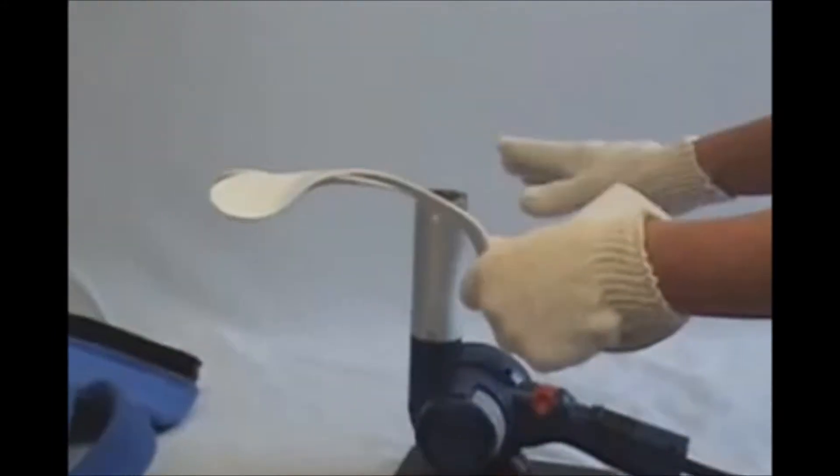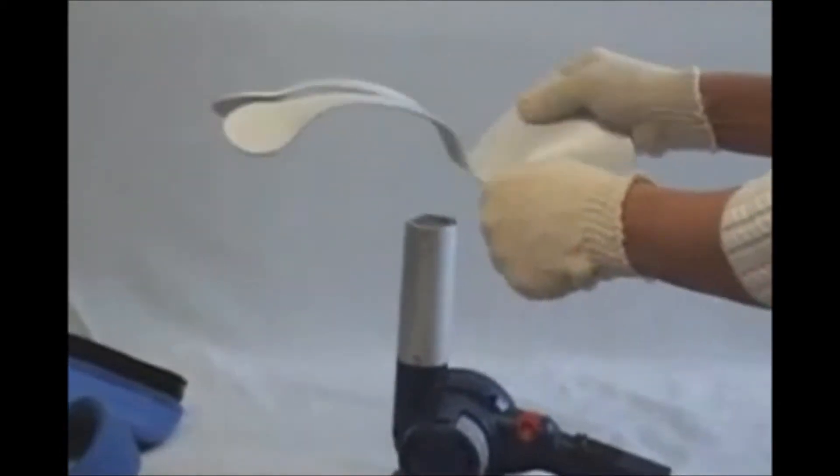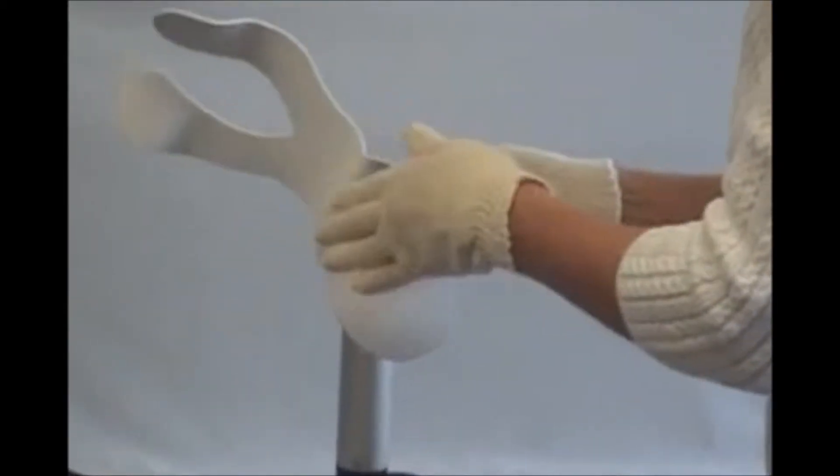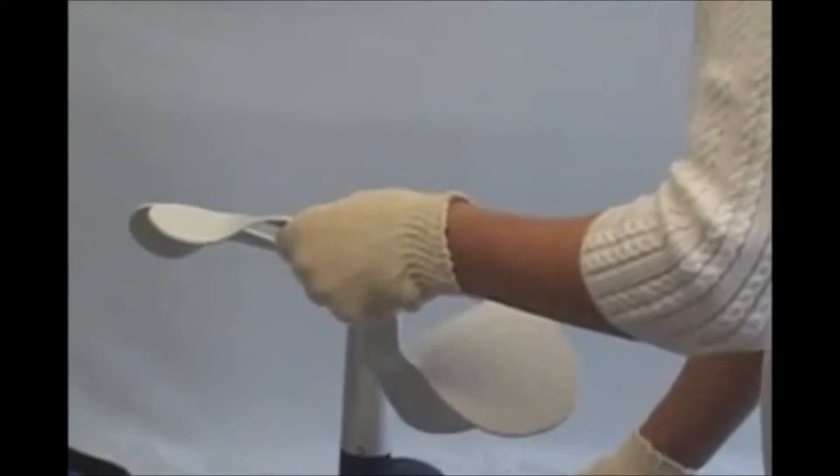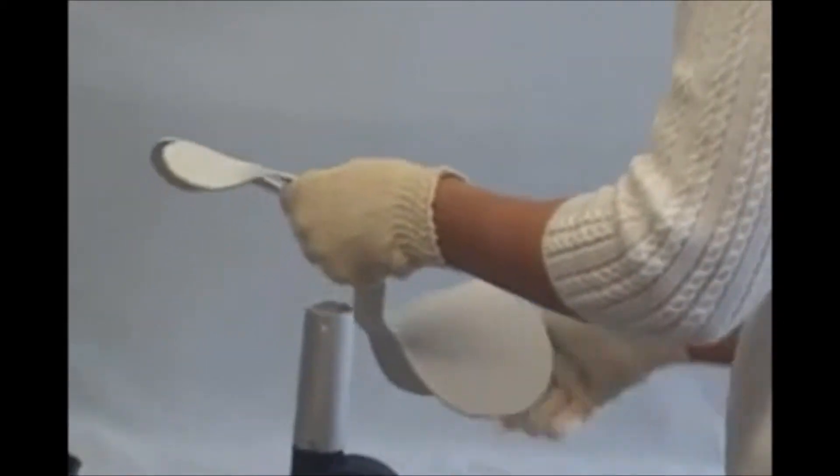You're going to turn the heat gun on and move the plastic. You don't hold it still or it'll scorch it. You want to heat an area just until it's barely pliable, remold it and let it cool. So I'm going to turn the heat gun on.